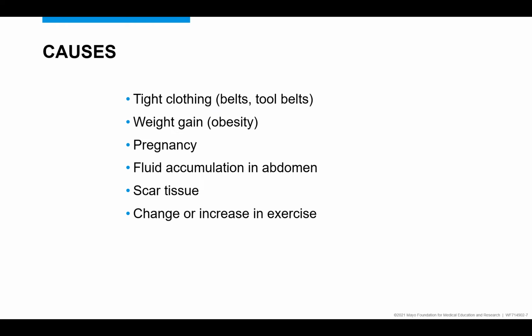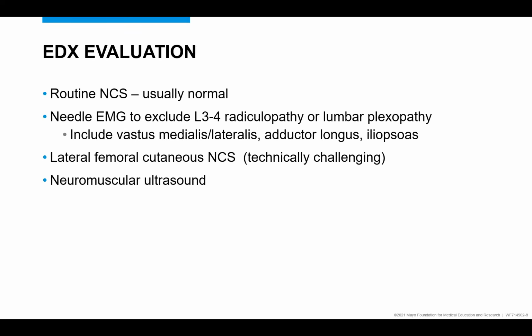But you can have these symptoms from change of activity if that nerve is being irritated or compressed or repetitively stretched. So how do we evaluate this in the electrodiagnostic laboratory? Well, this is a tough nerve to evaluate, the lateral femoral cutaneous nerve. It's a challenging nerve. It's a small sensory nerve, and it's a technically difficult nerve to test.